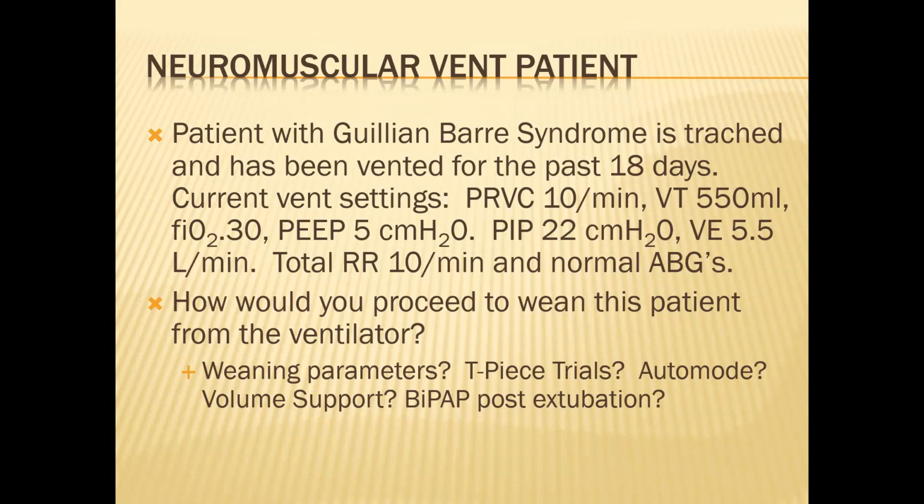Okay, that's a possibility. Yeah. Yeah, you gotta stick around. Would it be better to do that with SIMV PRVC rather than full support?